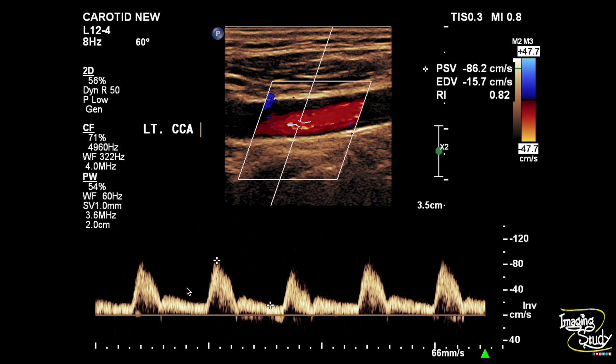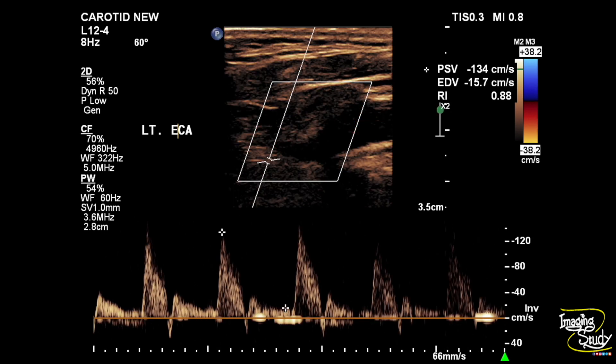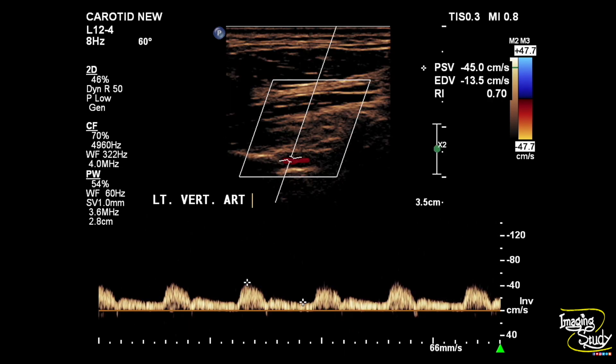This is the external carotid artery, also having good blood flow. This is the left vertebral artery showing normal blood supply. But the problem came when we tried to scan the left internal carotid artery.